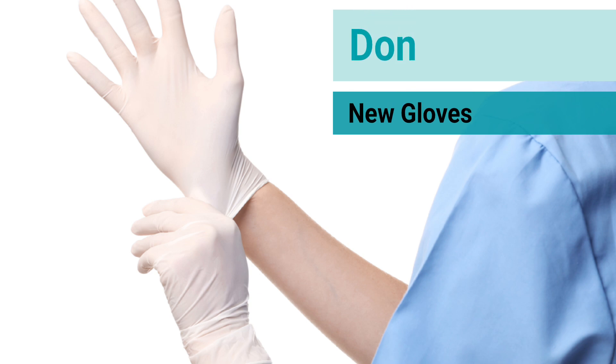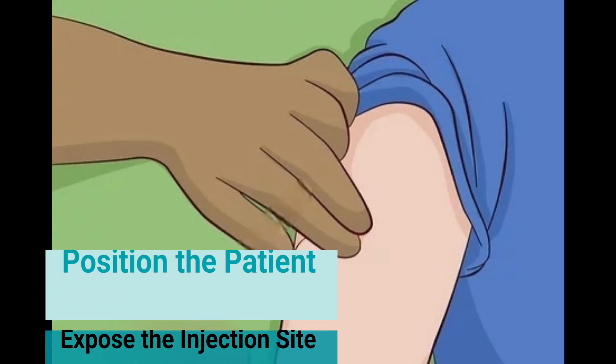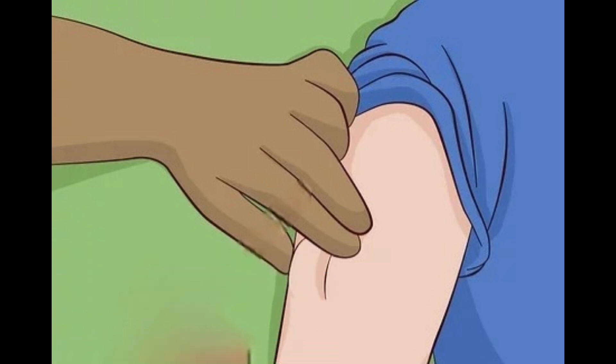Don a fresh pair of gloves, position the patient, and expose the injection site.